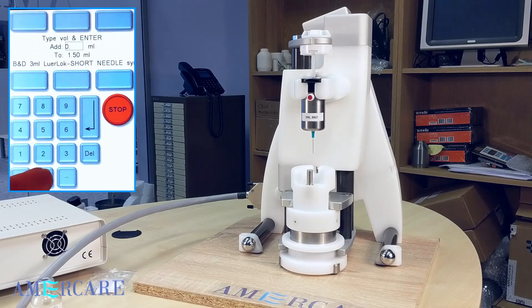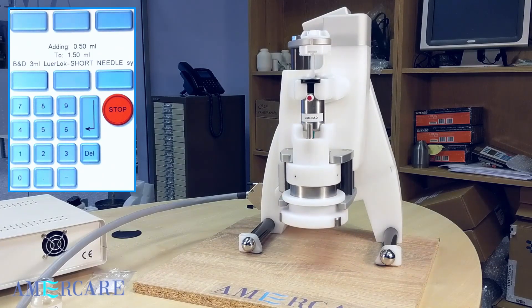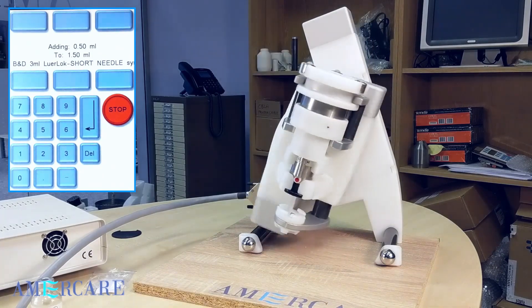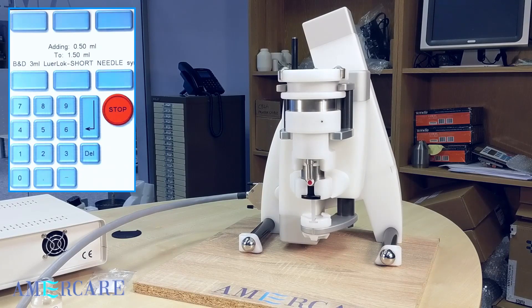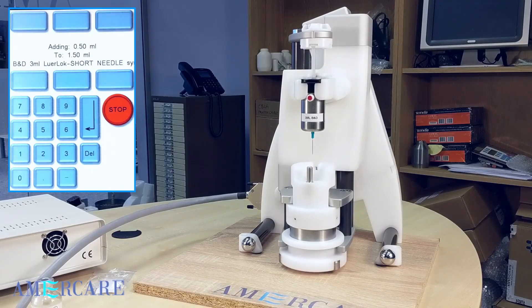In this example, we are adding 0.5 milliliters. Press enter to lift the shield up. The unit will invert and draw the additional volume required. It will then invert, lower the carriage and move the syringe into the unload position.